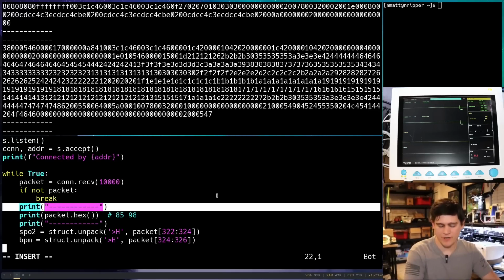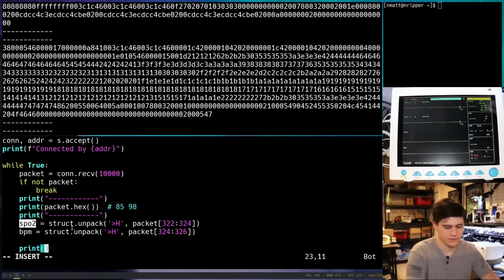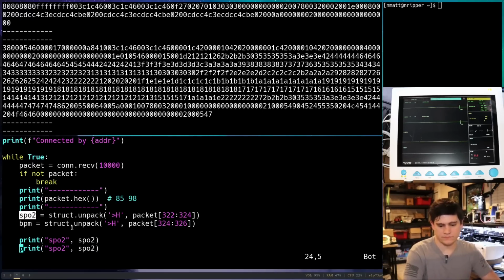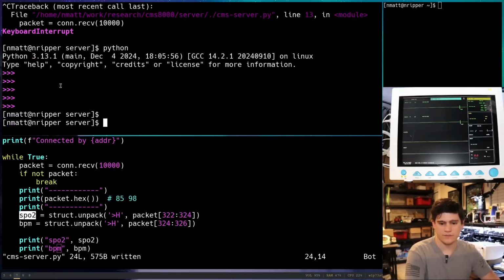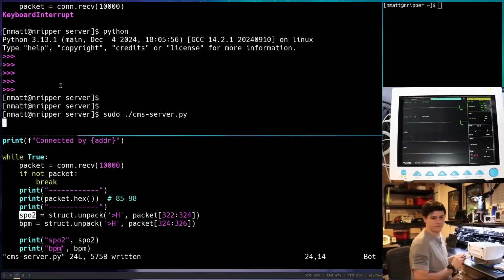So okay, but we're parsing these 2 values, and then let's print them out. Let's assume that we're going to parse these correctly, and so we're going to say that SPO2, comma SPO2, BPM, there we go. All right, so we're going to start this up again. And it's going to connect.